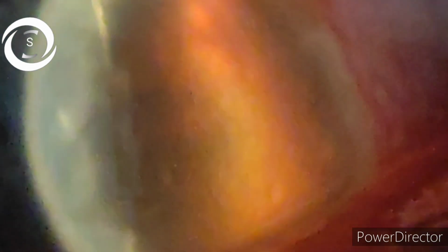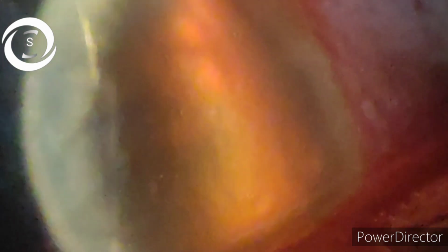So what happens when Descemet detachment occurs? There is overlying epithelial and stromal edema, loss of transparency of the cornea, striate keratopathy, as you can see here, pain, watering, and decrease of vision. On anterior segment OCT, the tractional Descemet membrane detachment is straight, while rhegmatogenous is folded, scrolled, crumpled, undulating, linear.